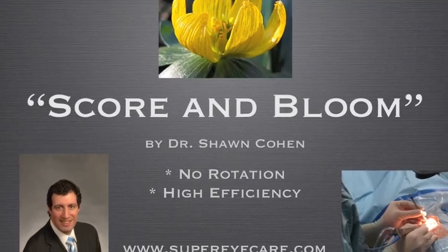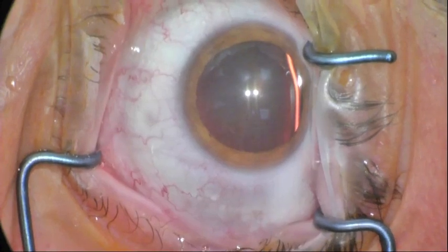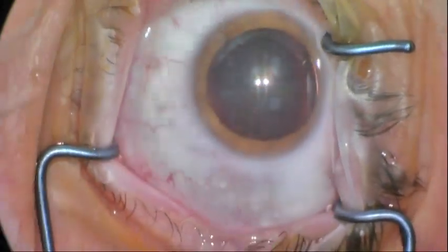Hello, I'm Dr. Shawn Cohen. I'd like to walk you through the score and bloom technique. In cases of posterior subcapsular cataract or posterior polar cataracts, there is a weakness or potential weakness of the posterior capsule.